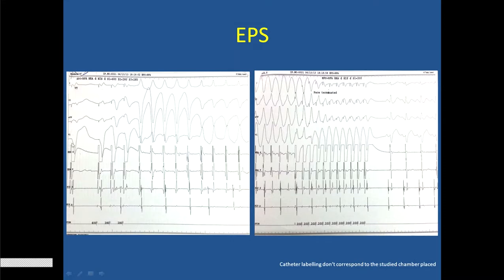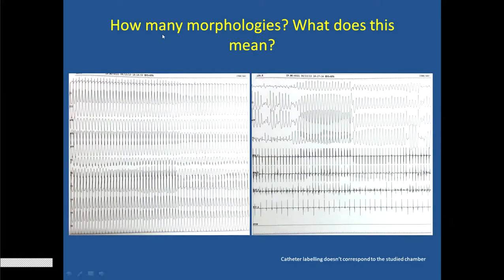On the table, we induce, these are the ventricular extra beats, and we induce the ventricular tachycardia, and we also do rapid pacing and terminate the tachycardia as well. This proves that there is a re-entry, because you are able to induce and able to terminate with pacing, and ATP would do great in such cases.